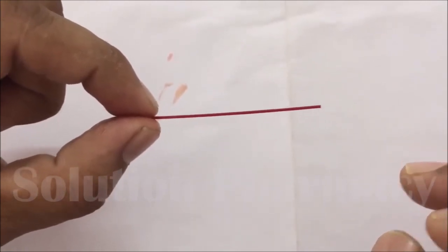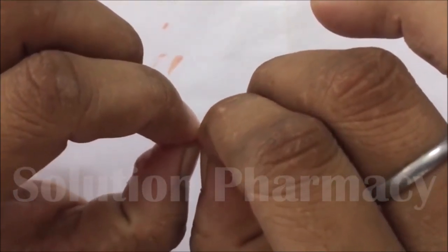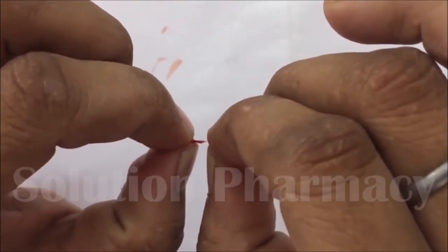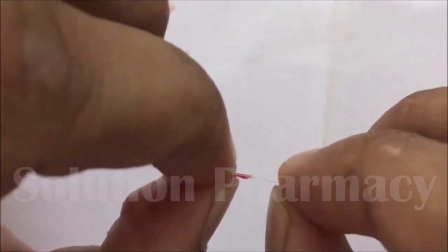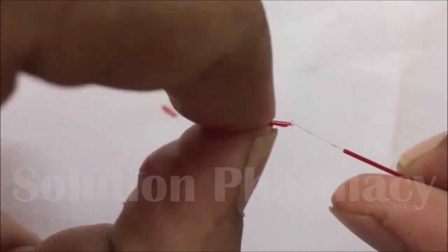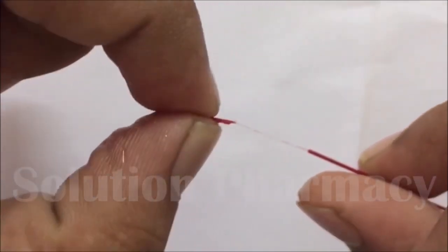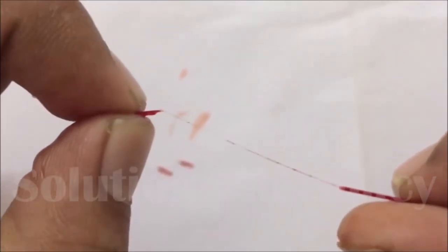Now again break a small portion of the capillary tube at one end, and now here you can observe the formation of a fibrin thread, meaning a thread of clotted blood between the broken ends of the capillary tube. Then stop the stopwatch and note the time, and this is the clotting time of our blood. This is how we determine the clotting time of our own blood.